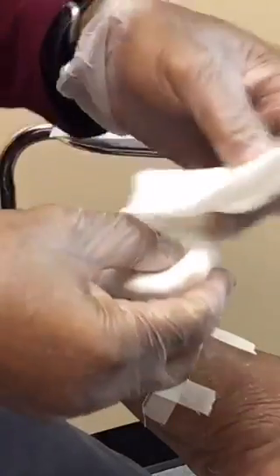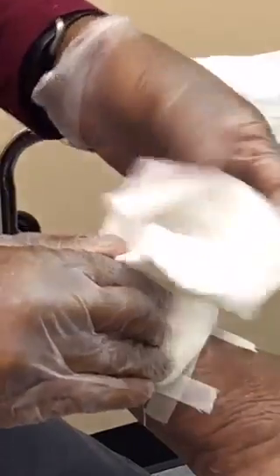This dressing is not to be removed for a week. The patient will come back next week and we will change the dressing.